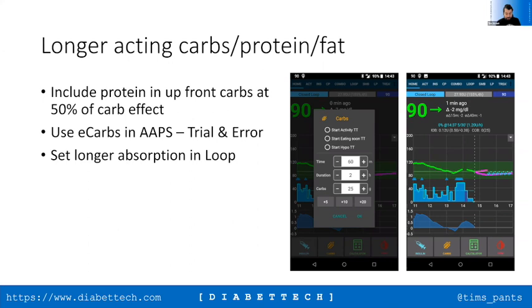You can then adjust your insulin dose. So there's a line that has CORR. Yeah. So if you look at it, if you put 50 in now, you'll have a result. If you then hit the negative button on CORR, it reduces the amount of insulin that it will give you at that point in time. That's okay. It's just a calculation you do yourself rather than it setting a rule up. That's right. Yeah.